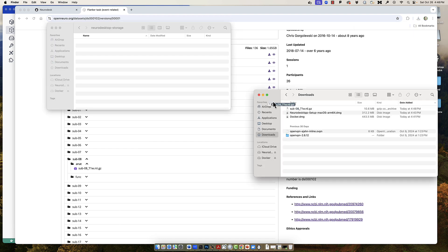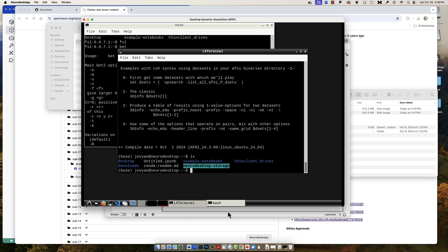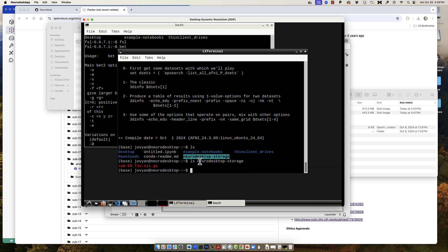If we then go back to Neurodesk and look within one of the already-opened terminals, from your home directory you can type 'ls neuro-desktop-storage' and then move that file into your home directory or whatever directory you want.